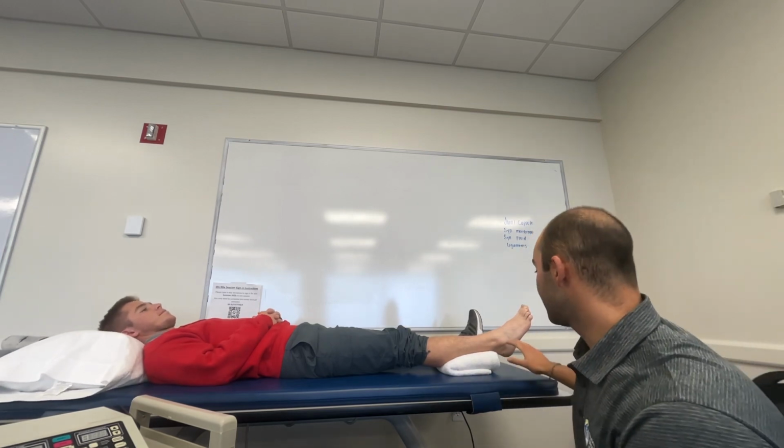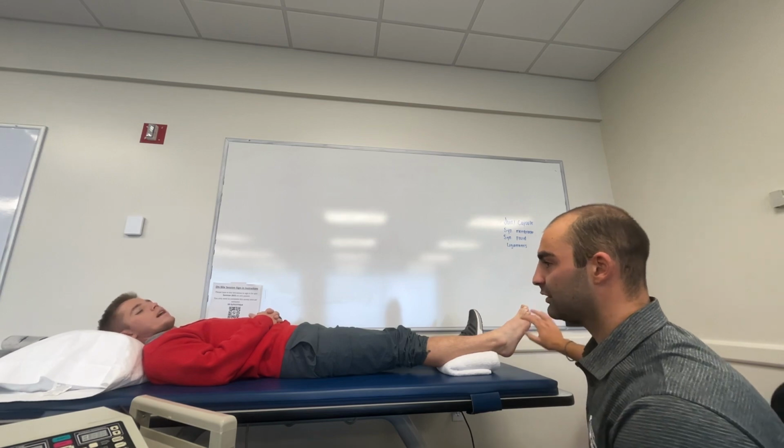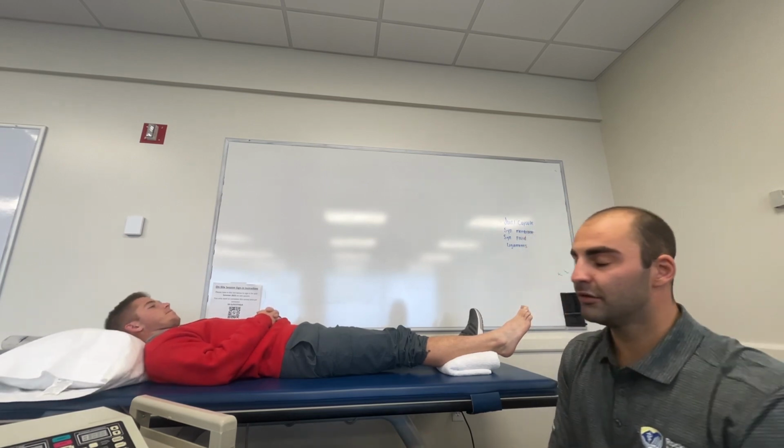Do we have any impaired sensation in this area? Can you feel your ankle relatively well? Feel your toes? Yes. Any numbness or tingling in that area? I can feel things down there. No numbness or tingling. Perfect. All right. So with that said, now we can set up our ultrasound machine to begin our modality. So first, we have to turn it on.